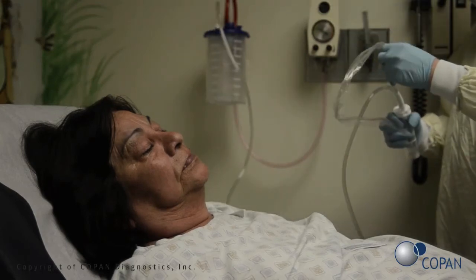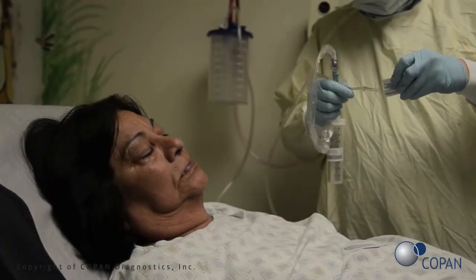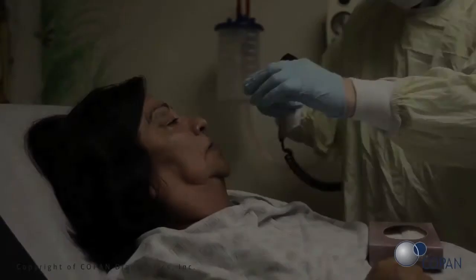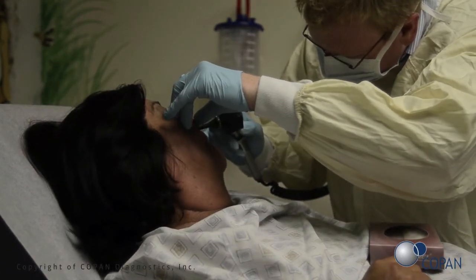Open the sterile aspirate kit and attach the tube to the syringe. Lubricate the tube using the lubricating jelly provided in the kit. Before beginning the procedure, confirm that the patient does not have a deviated septum or any nasal obstruction.